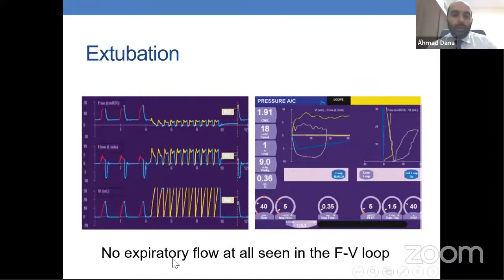So there is no expiratory flow. It is just inspiration, inspiration, inspiration. No expiration, so this means that it is extubated. It's different from a simple leak. Okay. Again here, see the inspiration, how it goes in this direction. It's not coming back. So this is, again, extubation: a continuous flow of air going without coming back. This doesn't happen except in extubation.